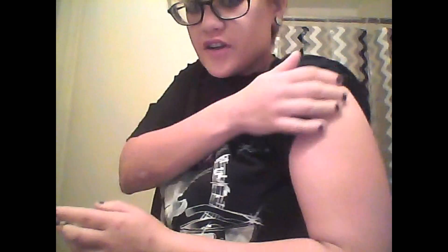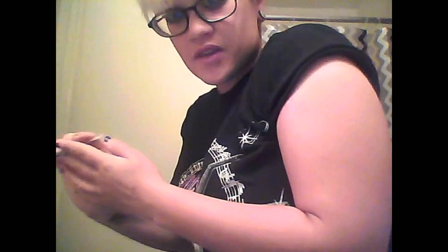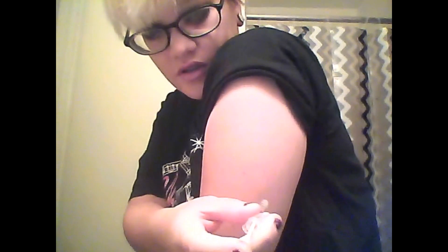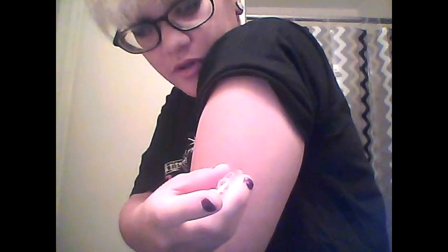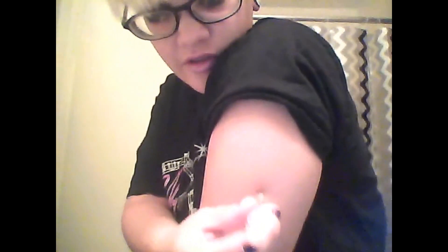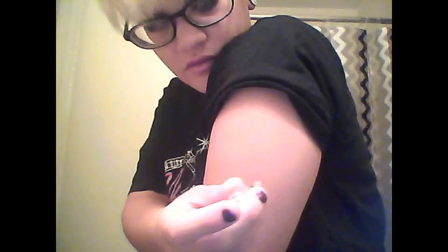I'm going to put half in my arm and then half in my stomach, just so I can show you how to do it in both places. There it goes — it's in my skin, just to show you all. You just press down and there it goes. It's in. No marks left or anything like that.